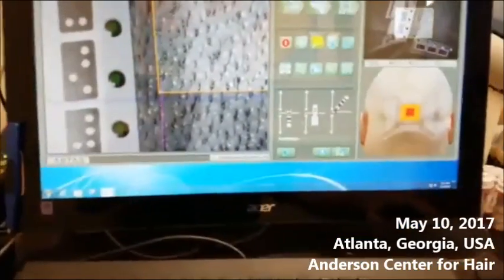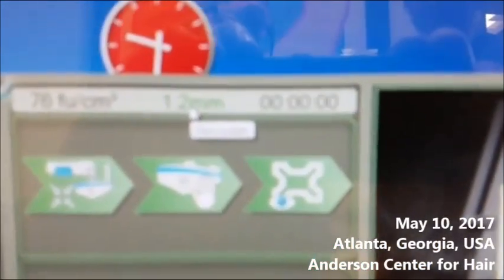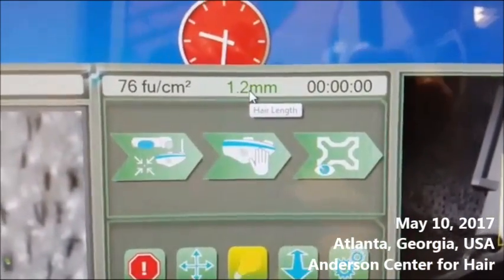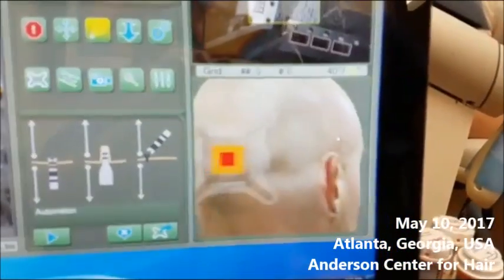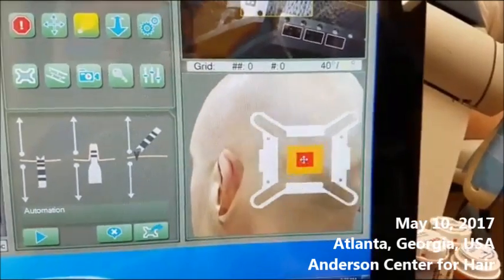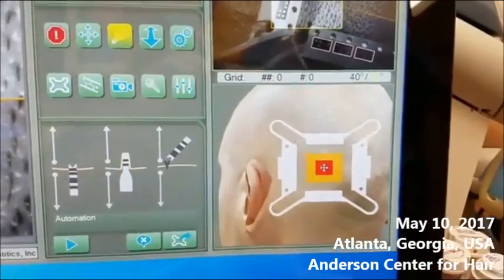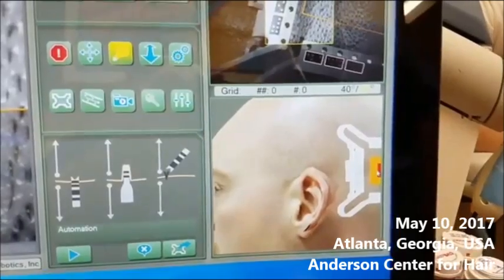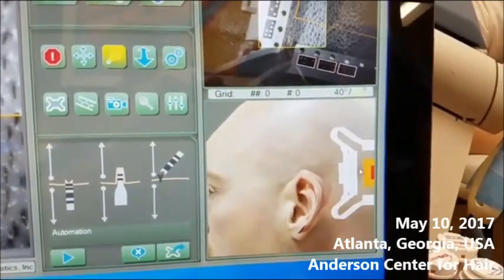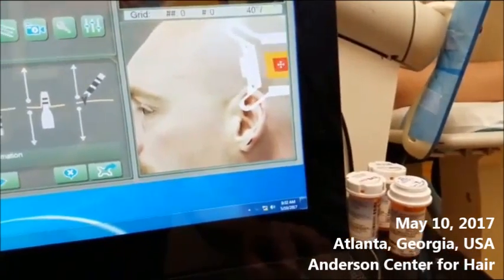We're going to come over here to the operator's station — this is kind of what I'm looking at. I'm going to make some adjustments. His hair length is 1.2 millimeters. His density is 76 follicular units per centimeter squared, which is very good. This is a virtual head — we've got robots and virtual reality here. This is where we tell the robot where on the head this grid is. We're starting on Charles's left side of his head at about this position.